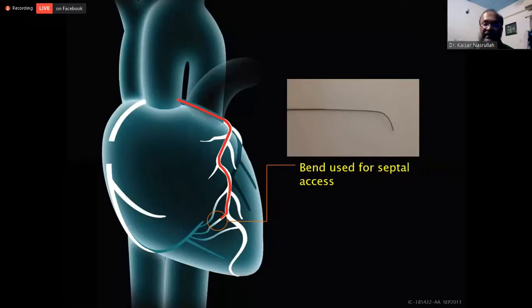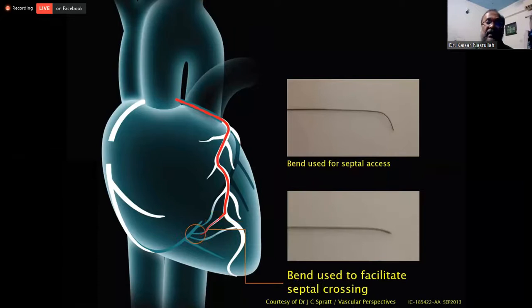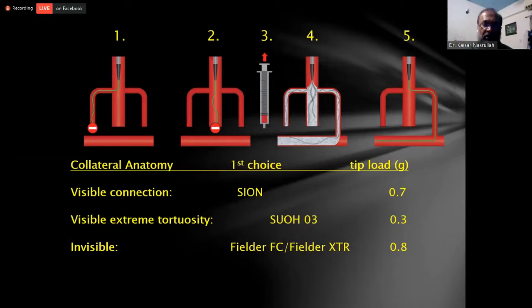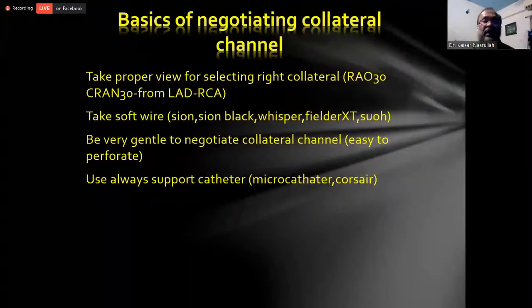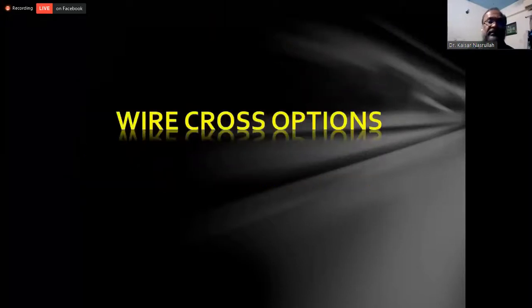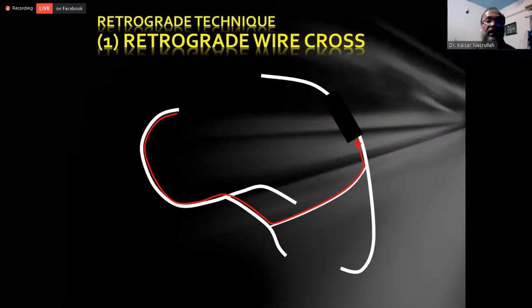And there is a bend to enter the collateral, an acute bend, and for facilitating the septal crossing, a small bend at the tip. For collateral wires, if there is a visible connection, I would prefer Sion. If extremely tortuous, then we should prefer SUOH 3. And if it is invisible or not clear, then Fielder XT-R, Pilot, or Fielder FC. The basics of negotiating collaterals are: take a proper view, take a proper wire, be very gentle, and always use a support catheter. Now, wire crossing options. One is retrograde wire cross.